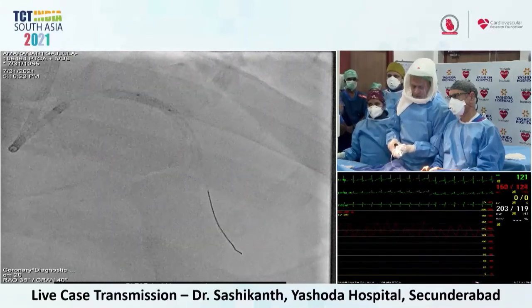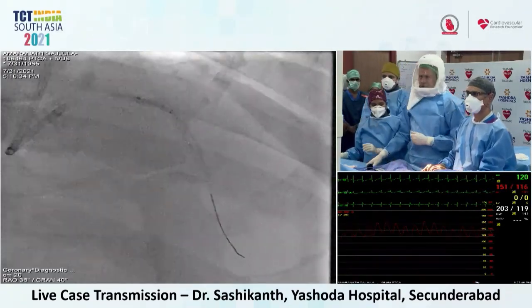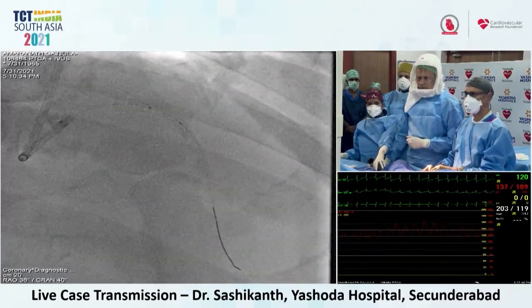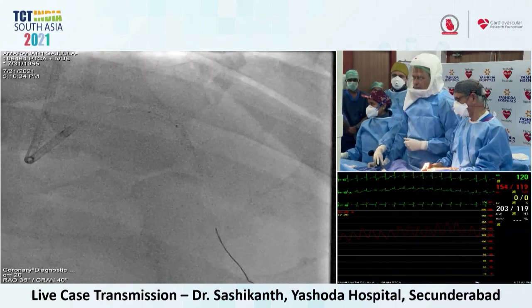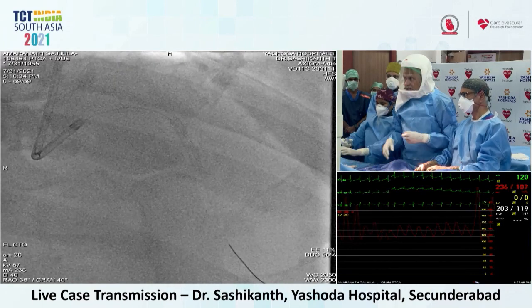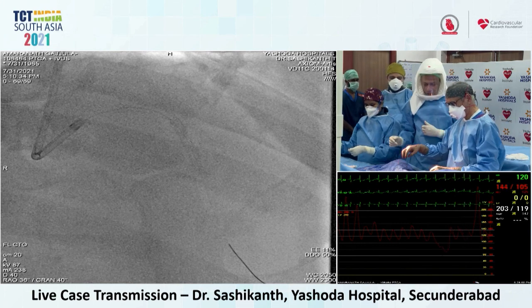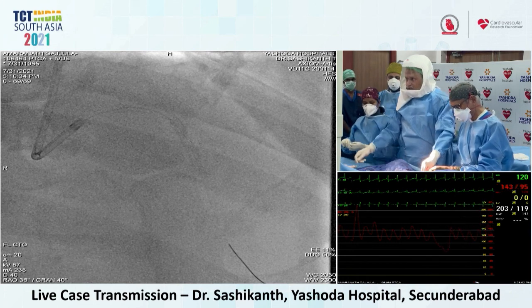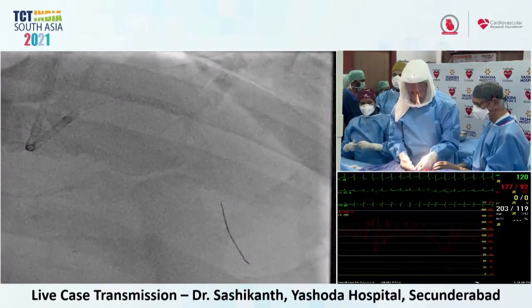Do you have the echo machine in the cath lab? Yes, it is ready. Can we do an echo? If the patient has some chest pain, or there are some ECG changes, effusion is one possibility. Can we have the echo? Yes, we'll have it in a few seconds. The patient is ready for the IVUS run.